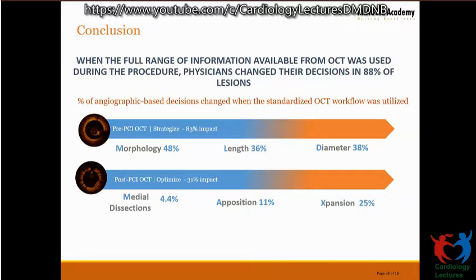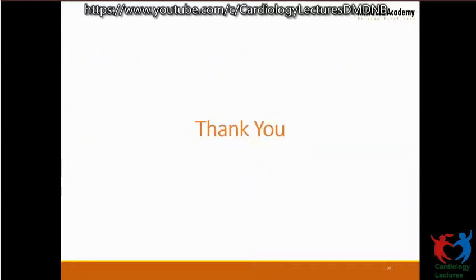But pre-PCI imaging is very, very important. It really orients you to the vessel morphology, as to what is happening within the vessel and what you need to treat. And post-PCI optimization definitely helps with dissections. It helps you find out whether you deployed the stent well, and most importantly, the expansion of the implanted stent is very, very important.